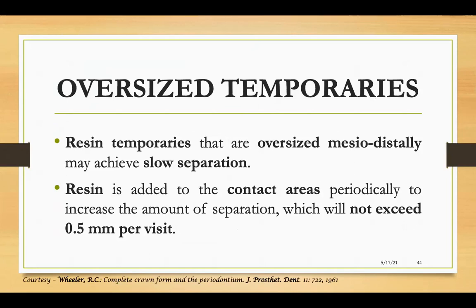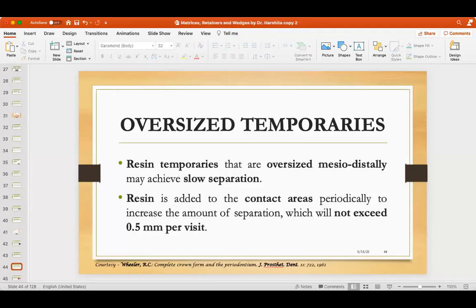Next is oversized temporary restoration. It's just the temporary restoration we give in an inter-appointment visit. I'm going to quickly show you an oversized one.